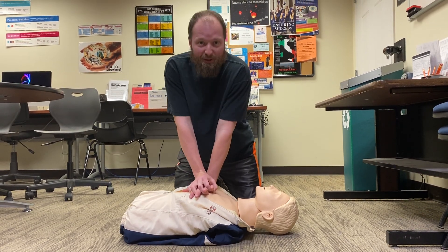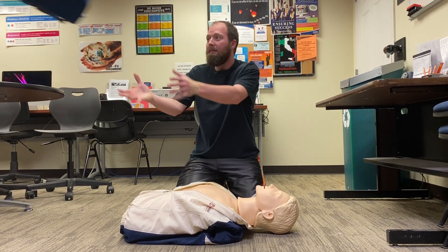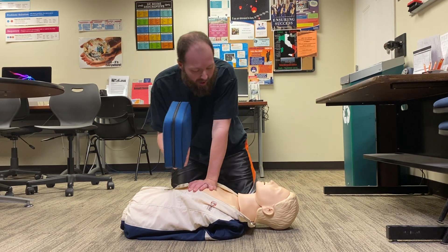When you're doing your compressions, it's always really good to get an AED. So when an AED shows up on scene, you're going to have to stop compressions, but you're going to want to apply the AED as quickly as possible.